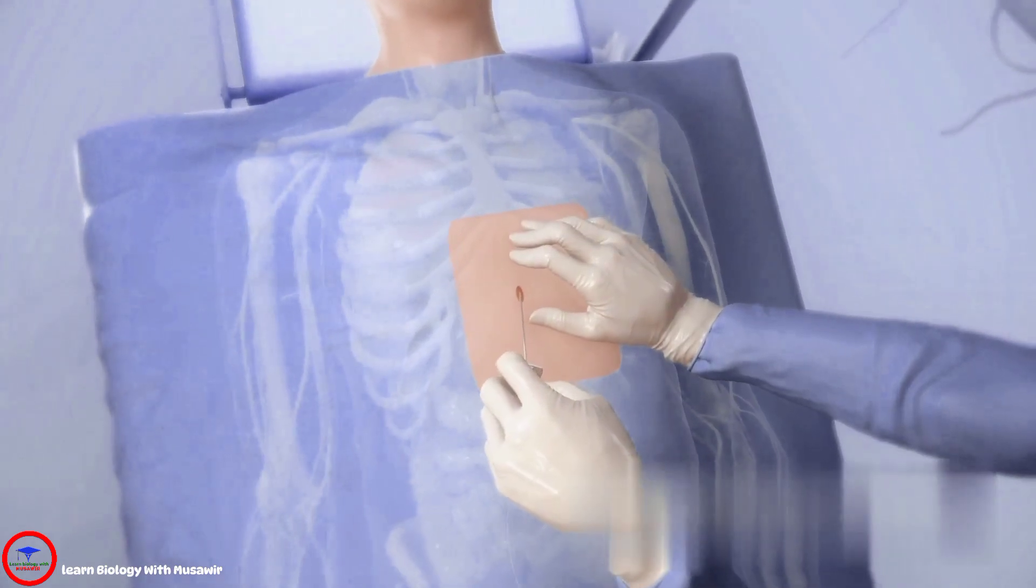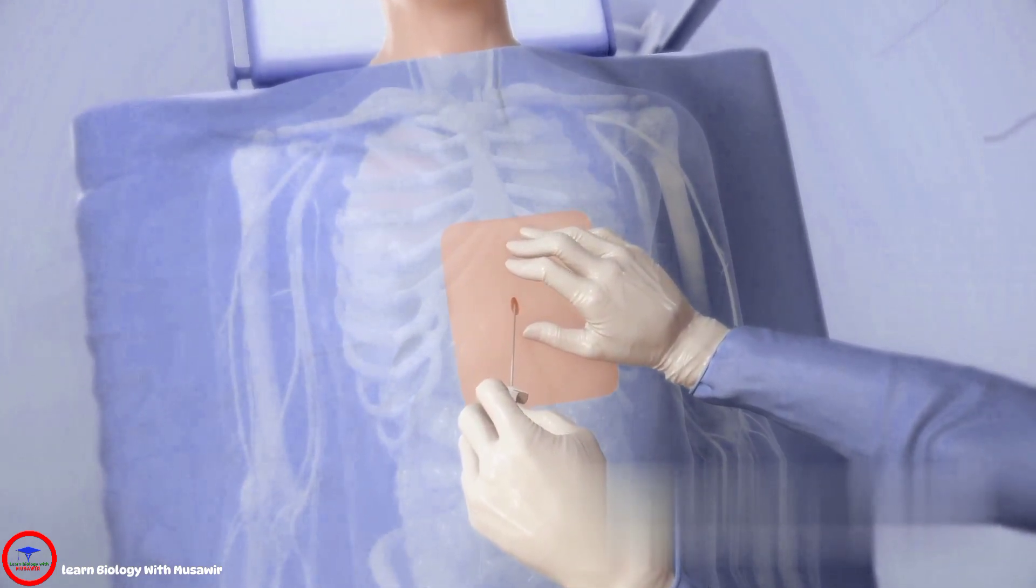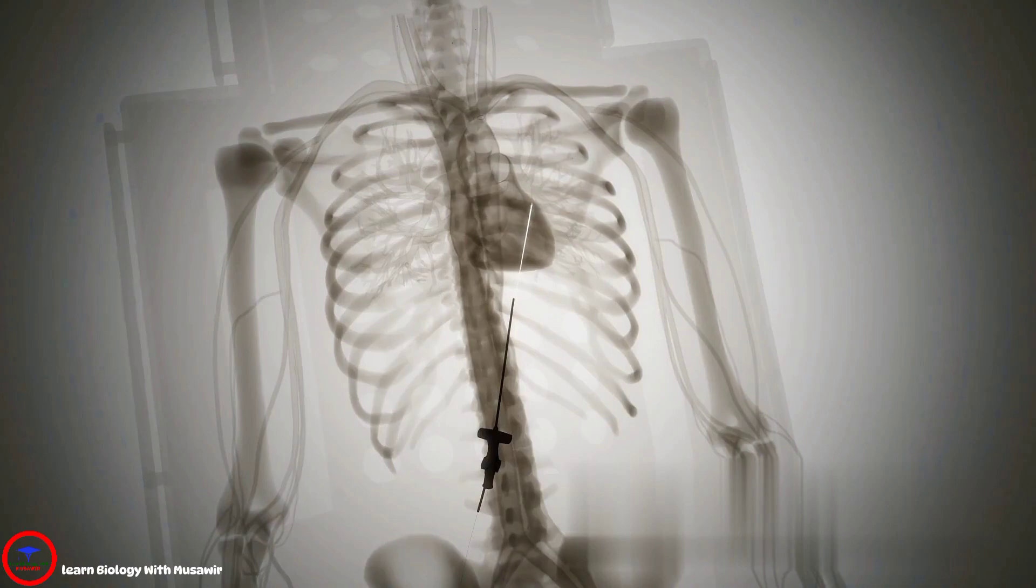Prior to insertion, the needle's trajectory is confirmed under fluoroscopy with the needle angled toward the mid-left clavicle.